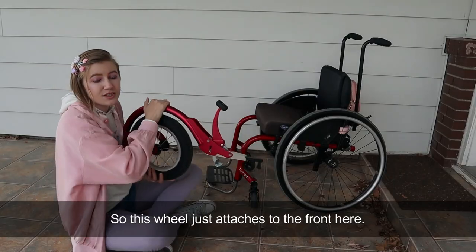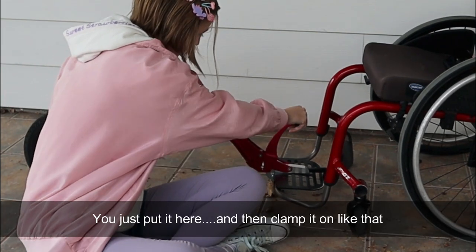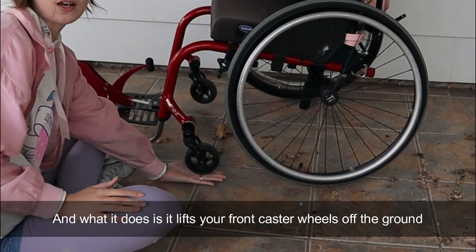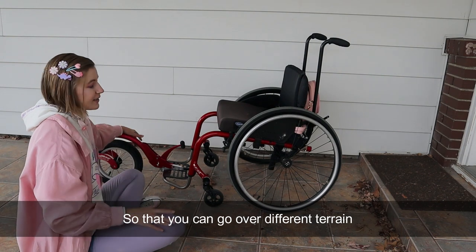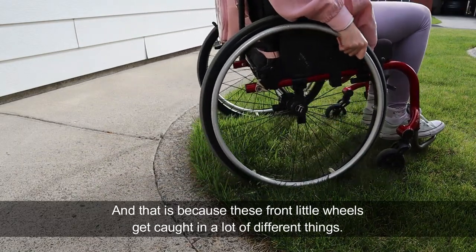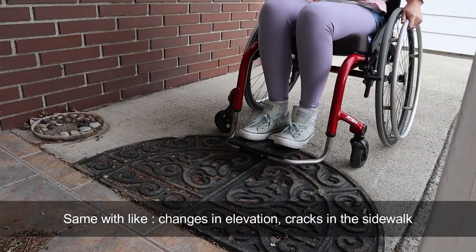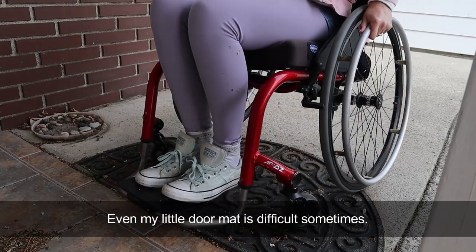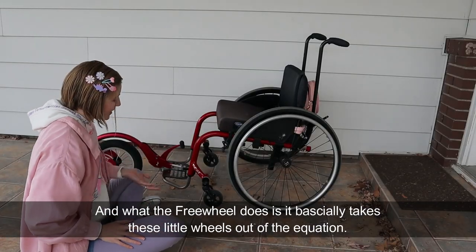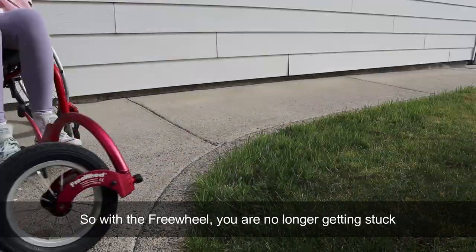So what is it? This wheel just attaches to the front here — you just put it here and then clamp it on like that. What it does is it lifts your front castor wheels off the ground so that you can go over different terrain. Wheelchair users have a hard time on grass because these front little wheels get caught in a lot of different things. If there's a hole in the grass, these little wheels just can't get over it, they get stuck. Same with changes in elevation, cracks in the sidewalk, even my little doormat is difficult sometimes. Not to mention things like curbs, gravel, or dirt. What the freewheel does is it basically takes these little wheels out of the equation — the ones that are getting stuck all the time — so with the freewheel you're no longer getting stuck.